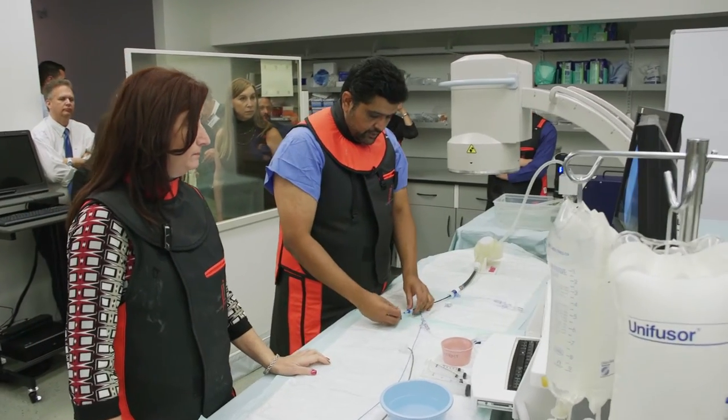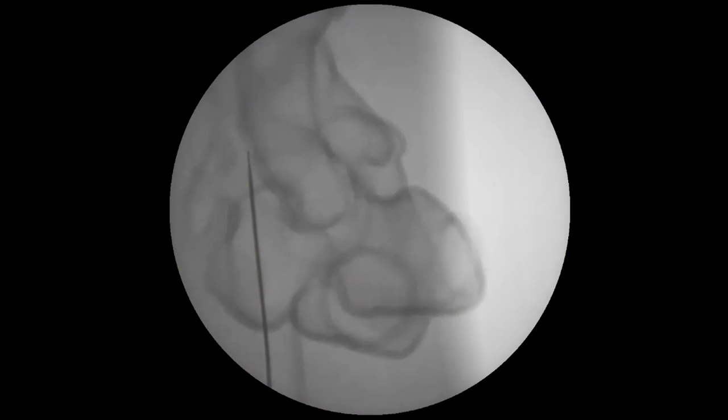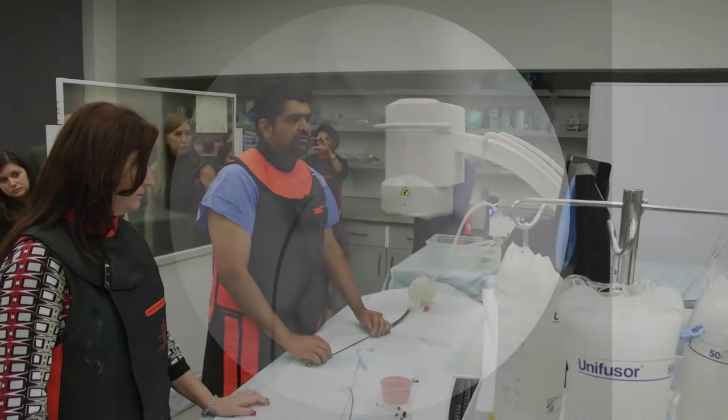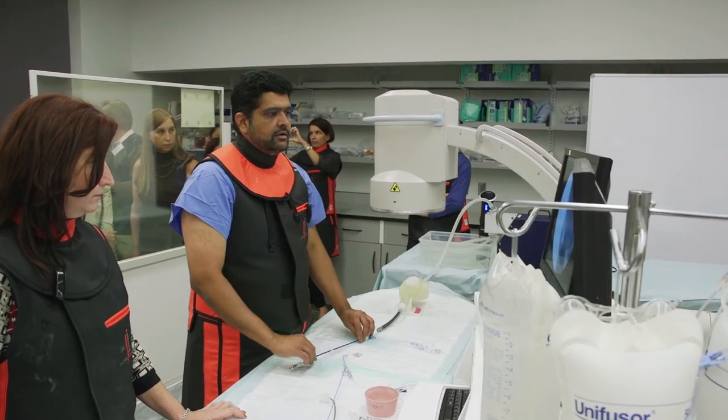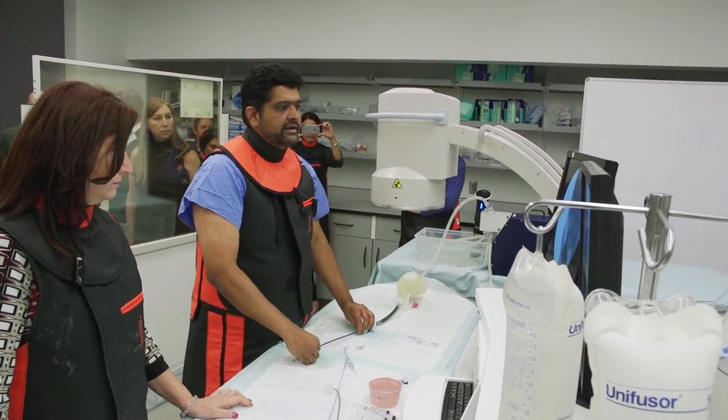You start with your sheath in the SVC. You'll see one drop and another drop — we can just move it down a little bit. And now I'm in the fossa. In the fossa, by turning this counter-clockwise or clockwise, I can go anterior or posterior.